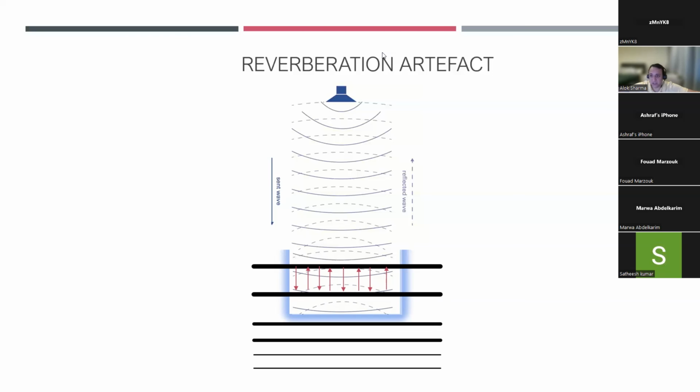They have nothing to do with tissue. And this is exactly what's happening at the level of the pleura. This is energy that's being dissipated and getting less and less. It's because of the way the sound waves interact with tissue, but it's not actually tissue, it's artifact. So it's not really there. And it's very important when it comes to trying to diagnose a pneumothorax.